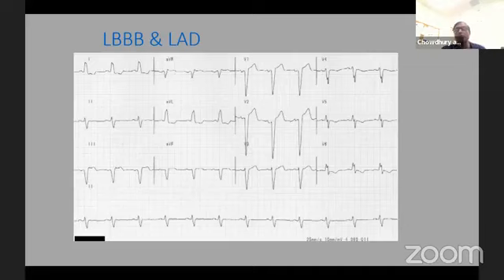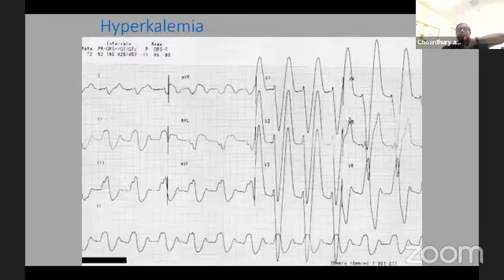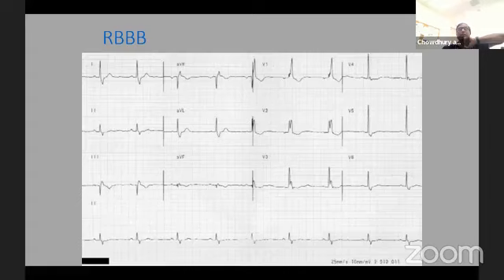I don't know, Atarbai, what will be your comment, but this is extensive conduction system disease. Clinical context is the only way to go. And with right bundle, you can still read the STEMI.